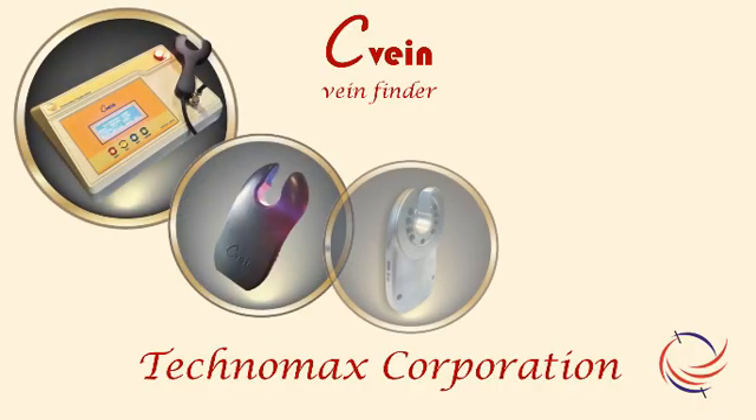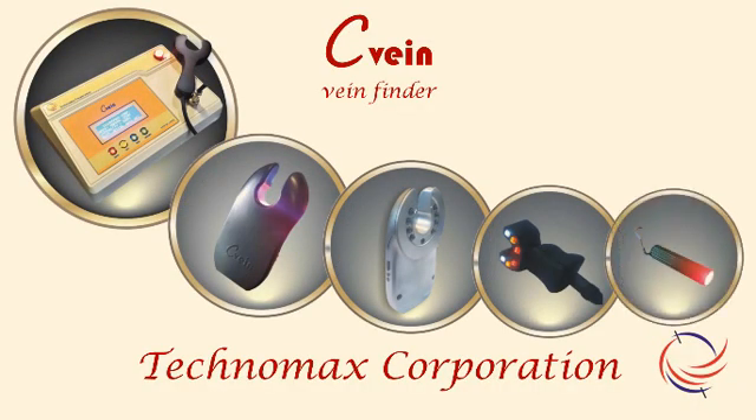Hello and welcome. We shall introduce different models of vein-locating device, C-Vein, in the following video.